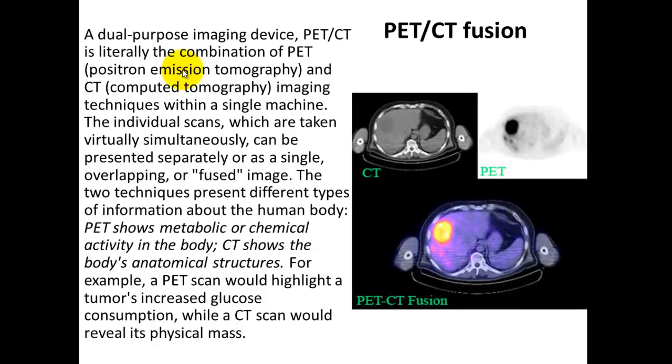Here's another view. If you can see this hotspot here, this is the combination of this area that's kind of hard to see, spatial resolution. And here we see that there's something going on, but it's kind of hard to pinpoint exactly where it's going on.